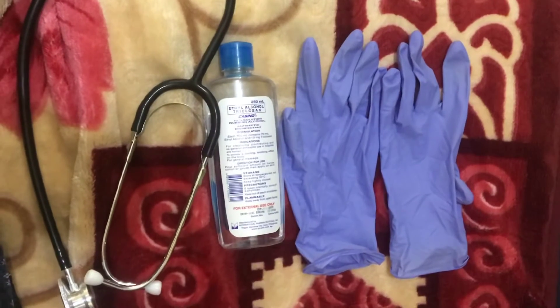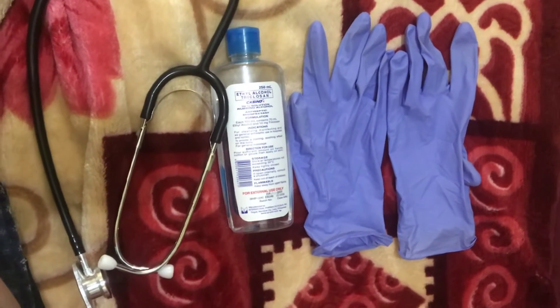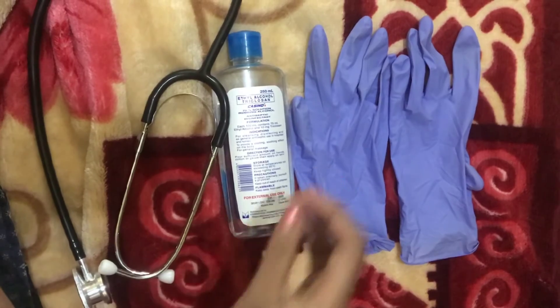Good day everyone. I'm your student nurse for today. For today's video I'm going to do segment three, which covers the lower and upper extremities and the cardio, and also segment four which is the abdomen. The equipment that we need are a stethoscope, alcohol, and a set of gloves. First, do proper hand hygiene.